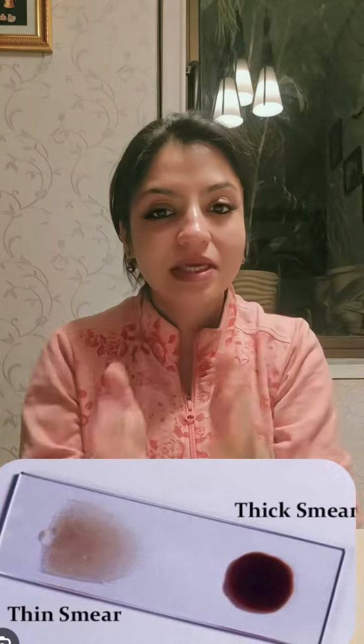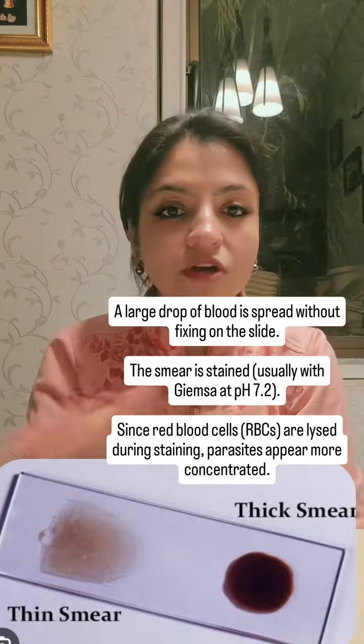So hi guys, today we're going to talk about this smear. What do you understand by the thick and thin smears in malaria? Whenever we're talking about a thick smear, we keep one drop of blood and we do not fix it. We do not fix it in methanol.